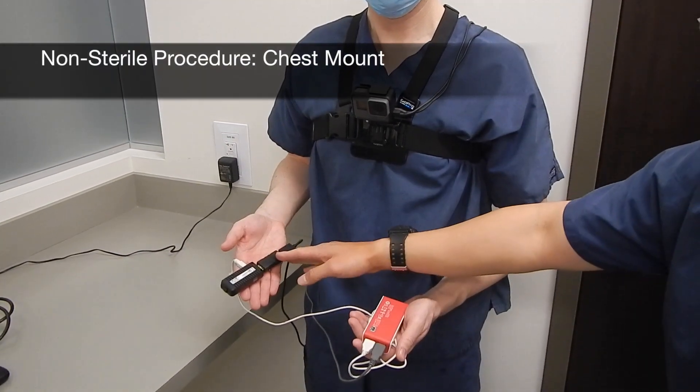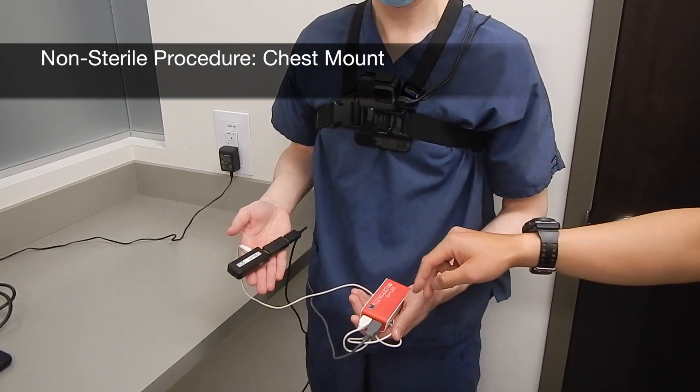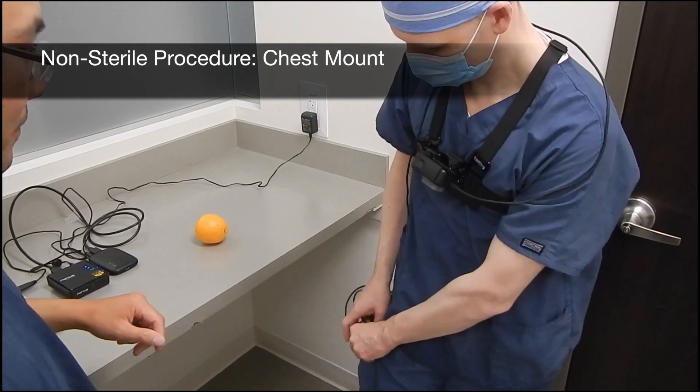For non-sterile procedures, it is preferable to use a chest mount as this reduces neck strain. The wireless transmitter and battery pack are kept in the surgeon's pocket.